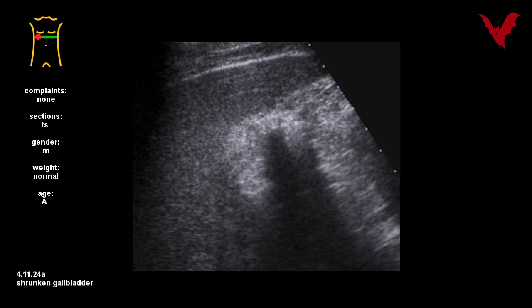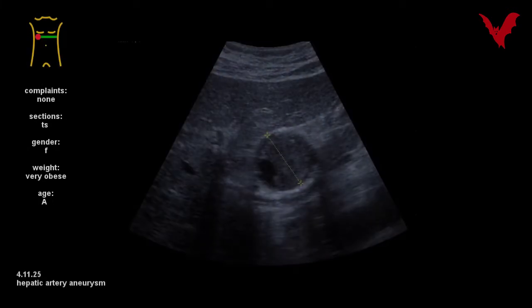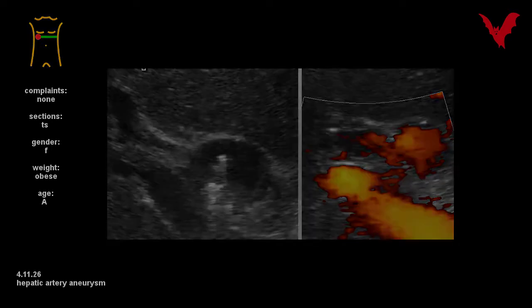They are without ascites in figure 24A and with ascites in 24B to C. Additional collaterals in portal hypertension in 24B. This aneurysm in figure 25 was observed before bubbles were available at all. In another case, in figure 26, CF was helpful in diagnosing also after coiling.